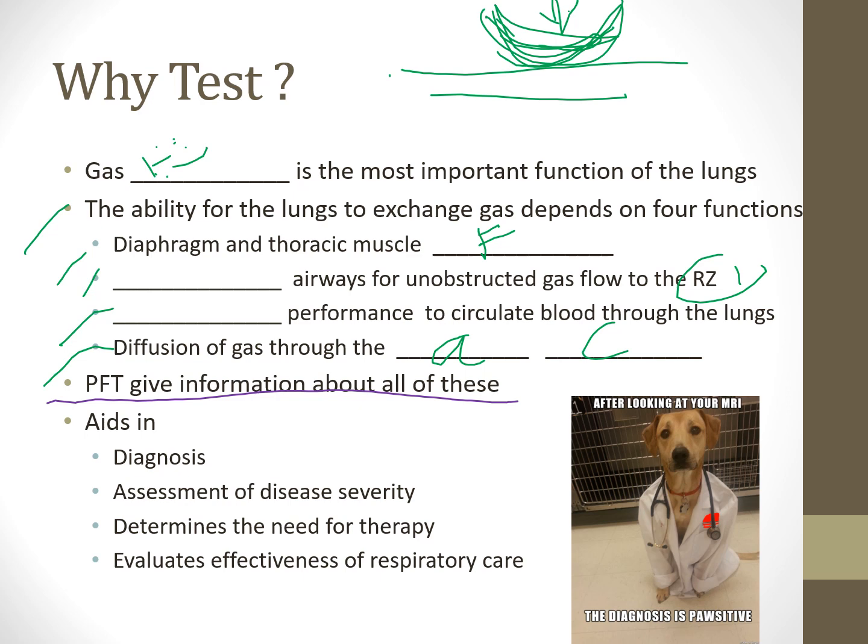So when we're looking at a pulmonary function test, what's the purpose of it if we have chest x-rays and we have stethoscopes? Well, we can aid in diagnosing. We can see how mild, moderate, severe their obstructive airways is. We can quantify how severe their restrictive disease is. We can quantify how bad their diffusion is. We can give those numerical values, and we can take action earlier in their disease process to hopefully help with better outcomes for that patient.